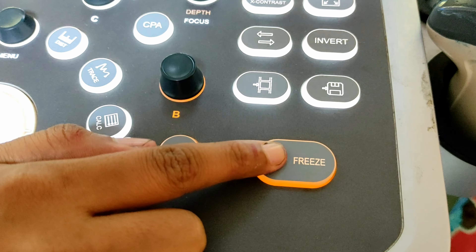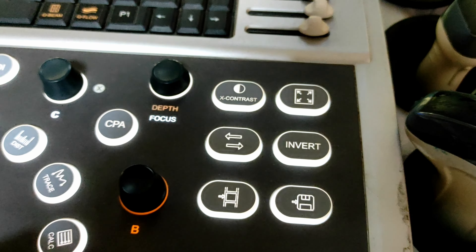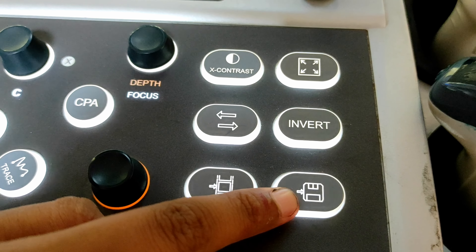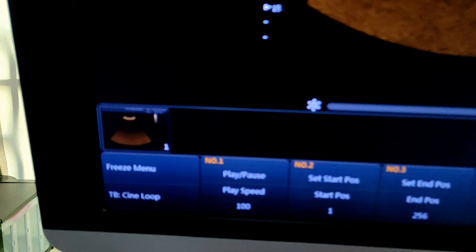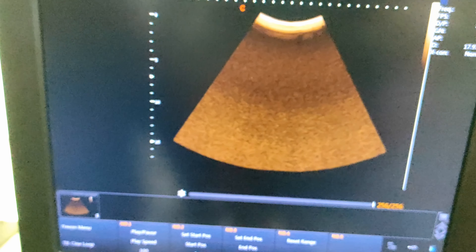This one is the freeze button. You can freeze or unfreeze your examination. This one is the save button — you can use it to save your image. Now press save, and see on the left lower corner of your screen — one image is saved.